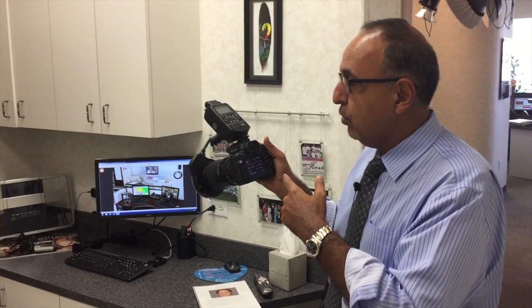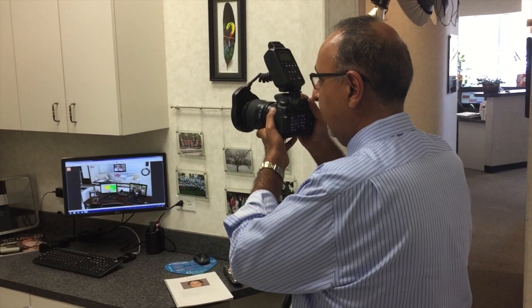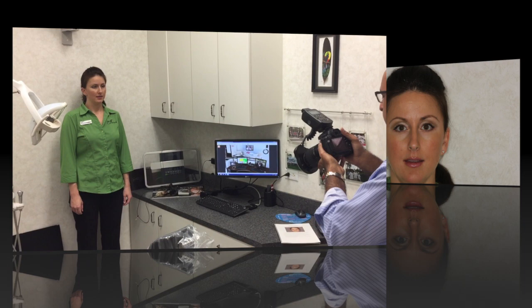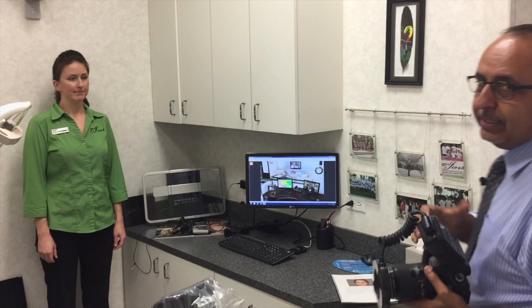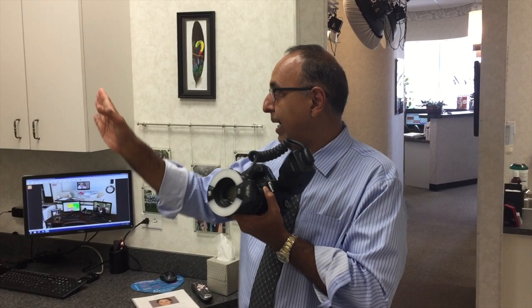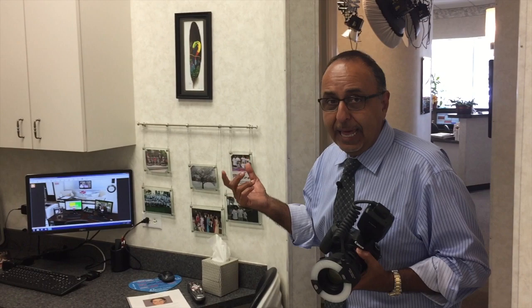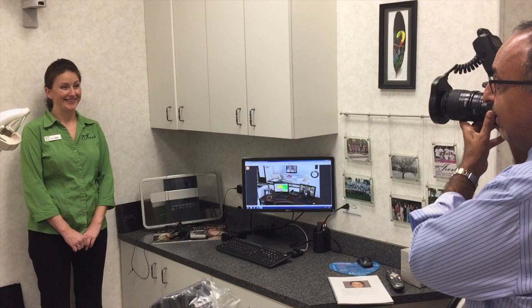She has dark hair, so I'll show you the difference between why we use dark versus light backgrounds. One more time — say 'M' and open your mouth without any expression. You can see the difference; the face is going to be shiny. Again, this is not a studio shot. The next shot is the same thing at rest but with the patient turned to the right. Then for the smile shot, I don't tell patients to smile because it's hard to smile on command — I tell them to laugh, or I really try to make them laugh.